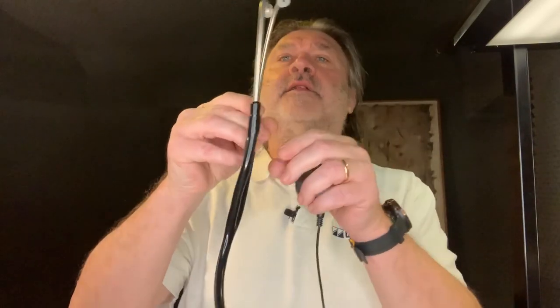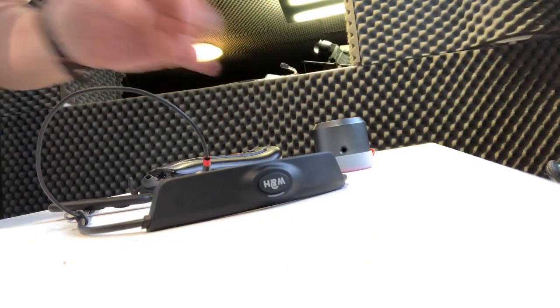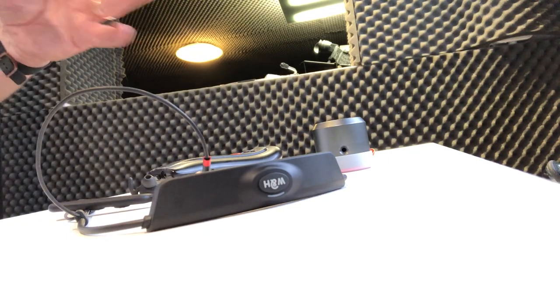This is a plug-and-play design, so you can plug in a traditional stethoscope and use it like a traditional one. And with the headphones, we can actually do it remotely.